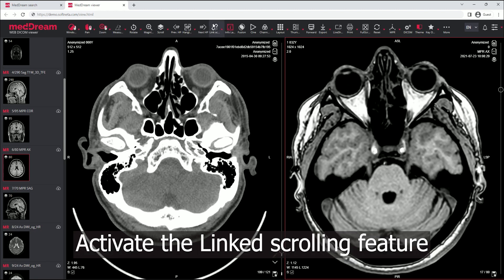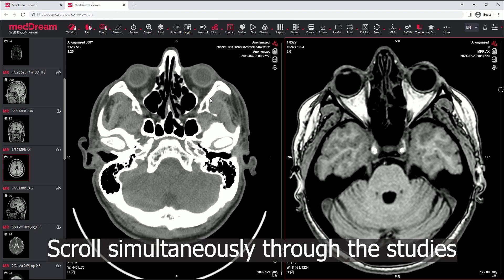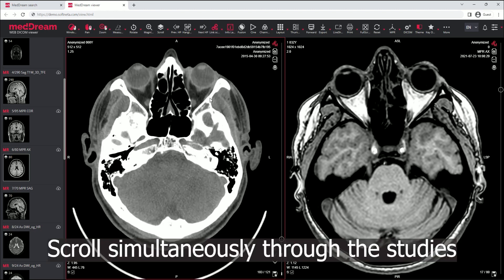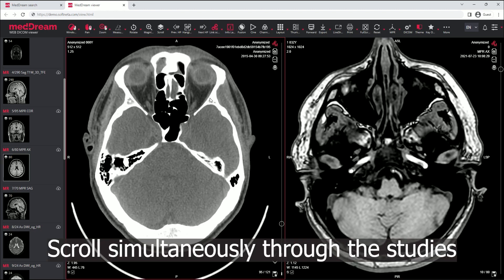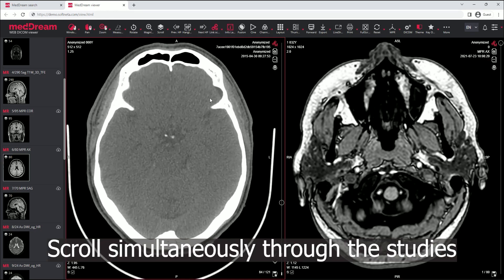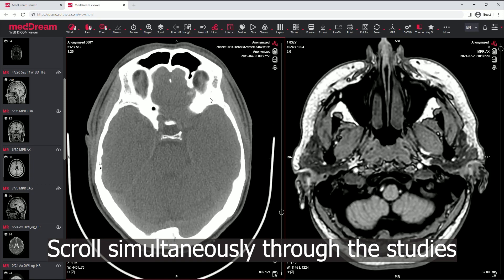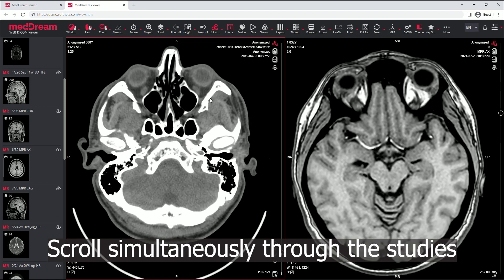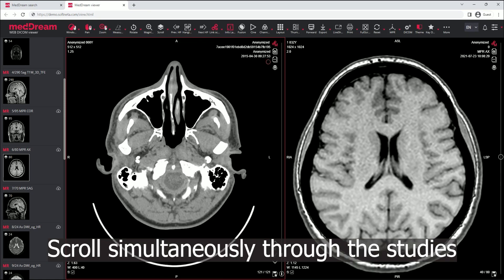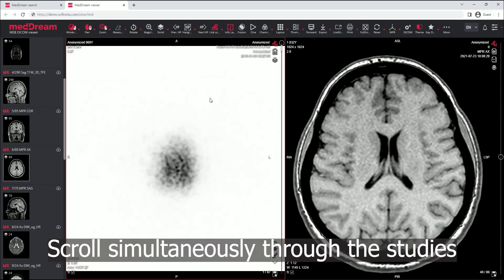Activate the linked scrolling feature. Use the mouse wheel to scroll simultaneously through the series.